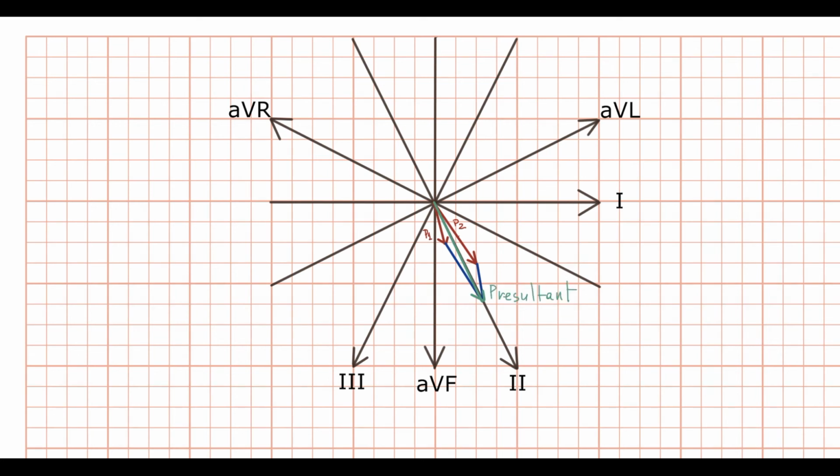It simplifies ECG analysis, because if we know the normal orientation of resultant vectors, we know how in normal condition it should look on ECG. So basically we know the normal morphology of ECG complexes, and also we can say why they become deviated in pathological conditions. For example, there we see the normal orientation of the resultant vector of atrial depolarization that on ECG is represented as the P wave.